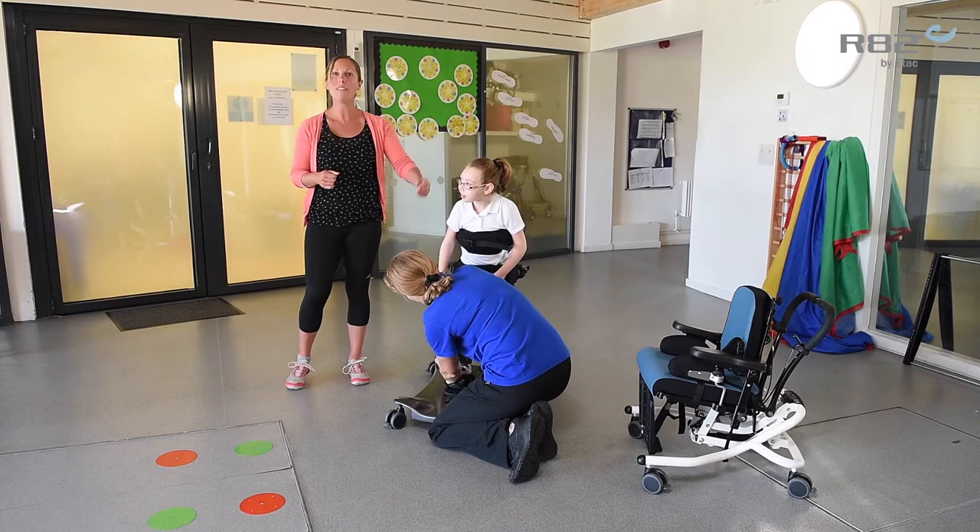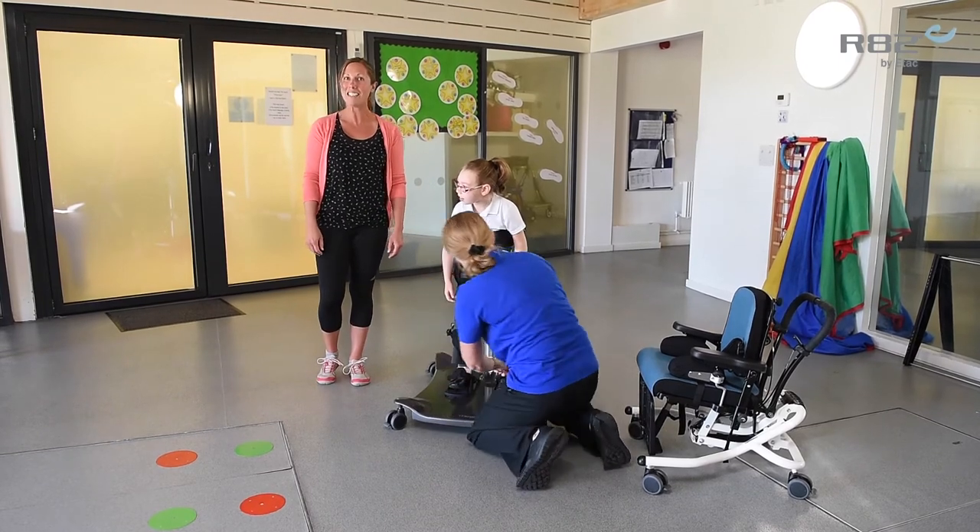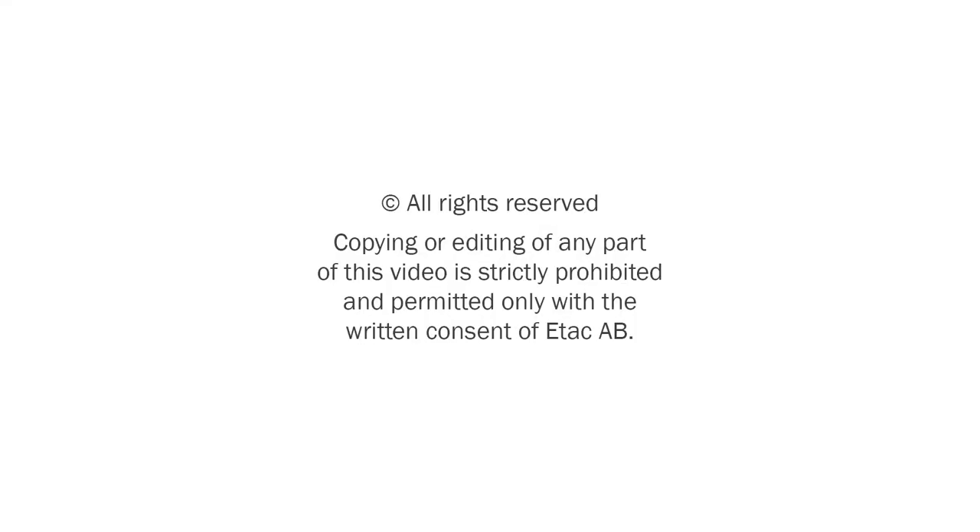And there we are, we're into the Meerkat. And that's how easy it is to transfer into the Meerkat standard.